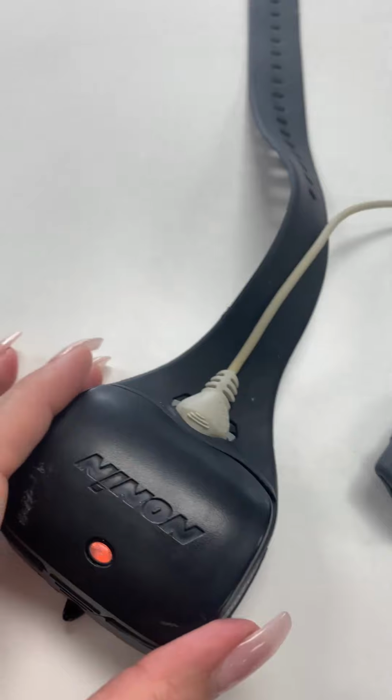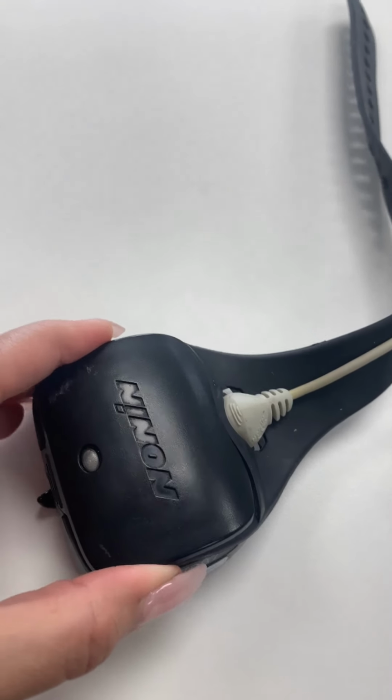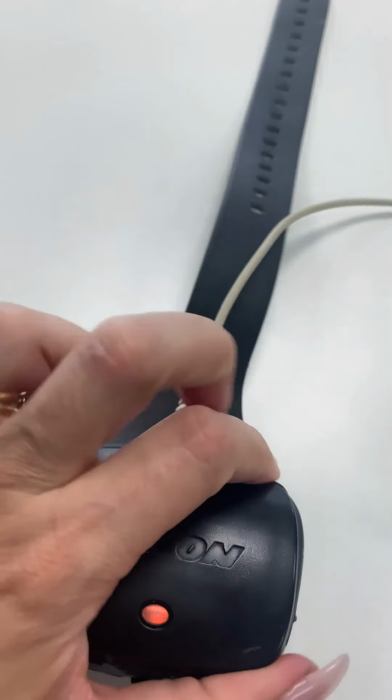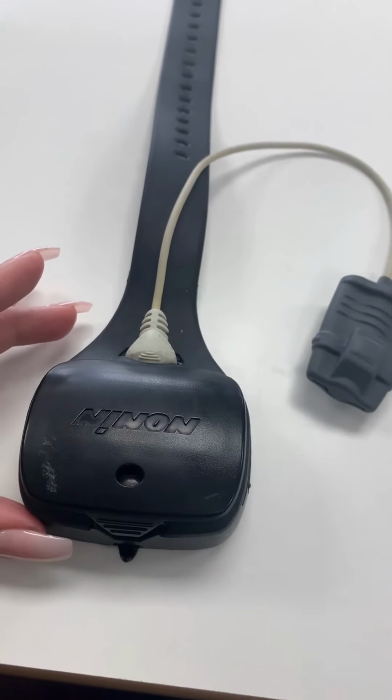In the morning, when you are done, you finish your sleep study, loosen up the lid to preserve the battery for the following night.